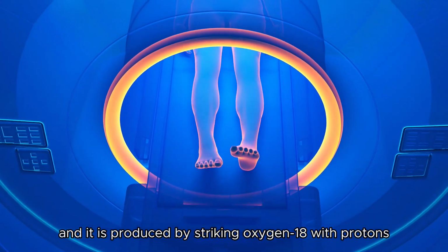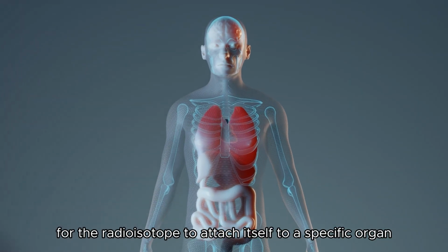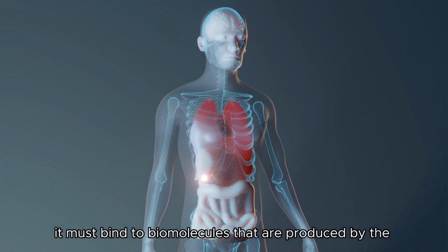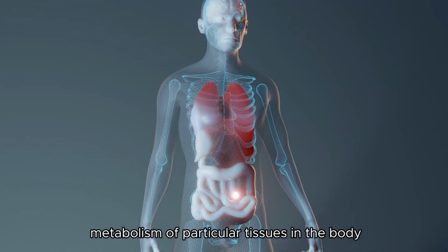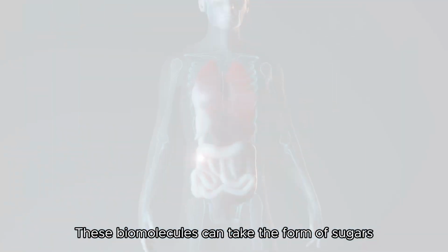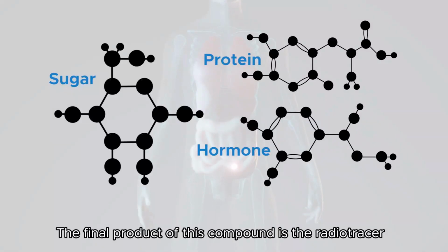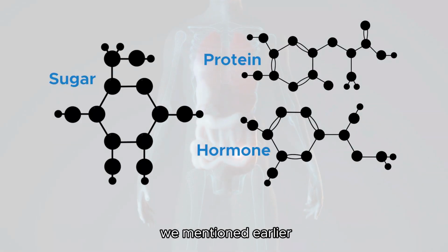This particular isotope is commonly used in PET scans to detect cancer, and it is produced by striking oxygen-18 with protons. Now, for the radioisotope to attach itself to a specific organ, it must bind to biomolecules that are produced by the metabolism of particular tissues in the body. These biomolecules can take the form of sugars, proteins, or hormones. The final product of this compound is the radiotracer we mentioned earlier.